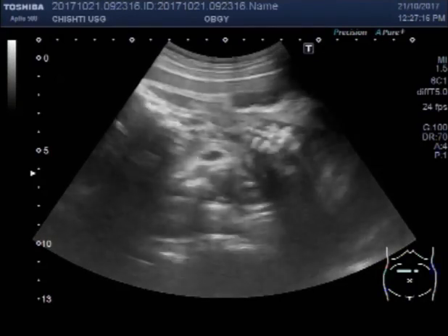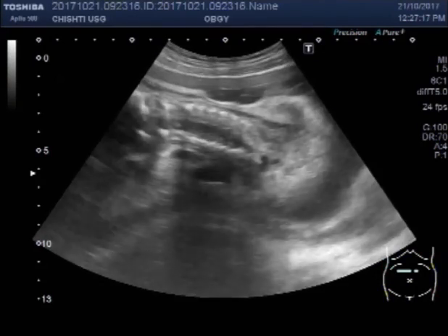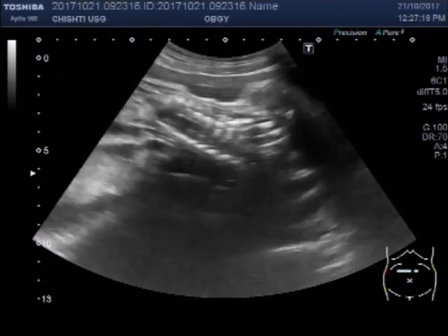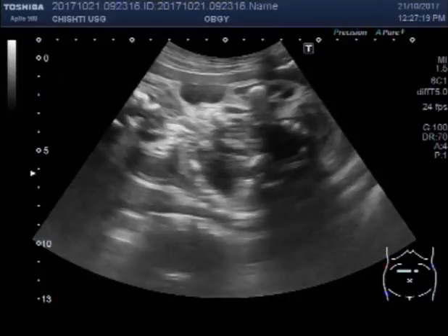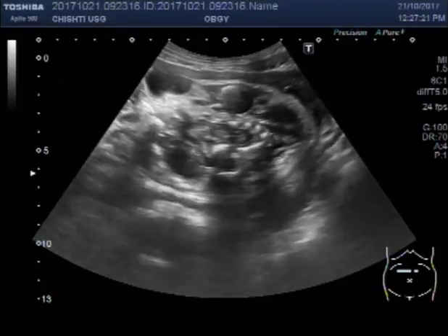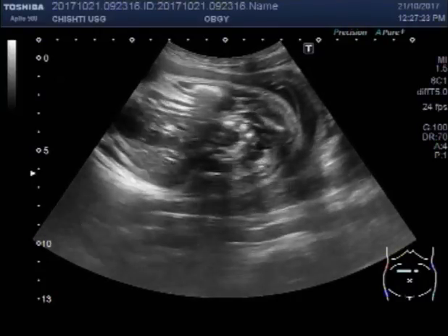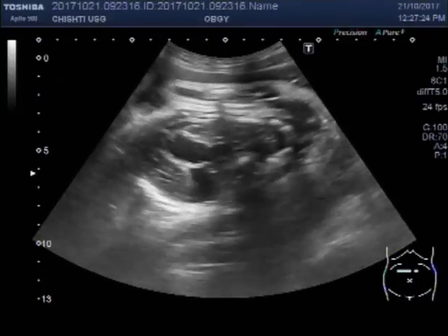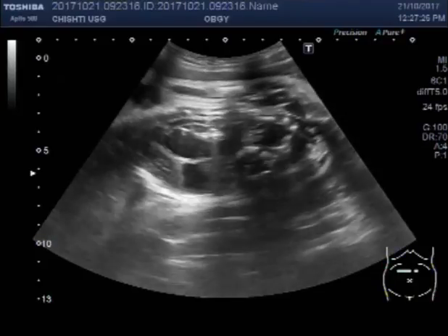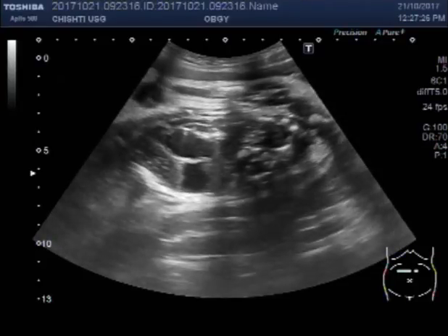There is mild edema of the soft tissue. This is usually seen after death of the fetus.